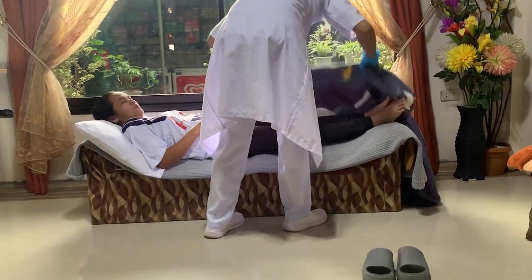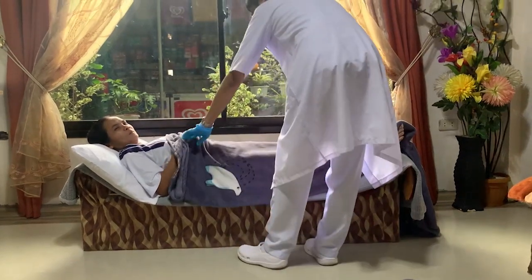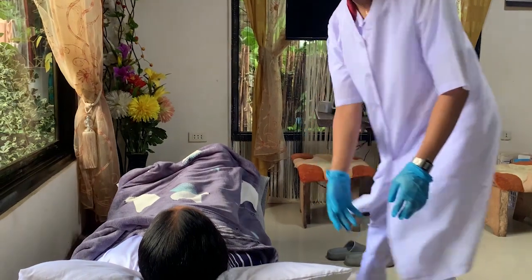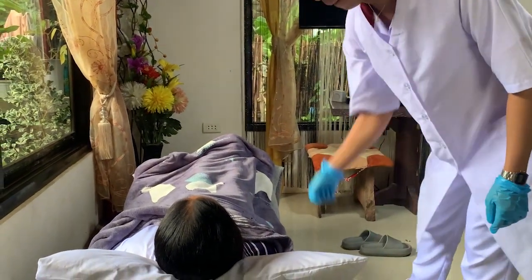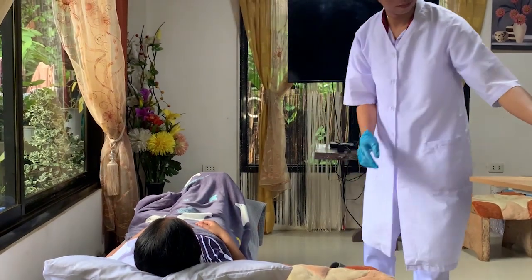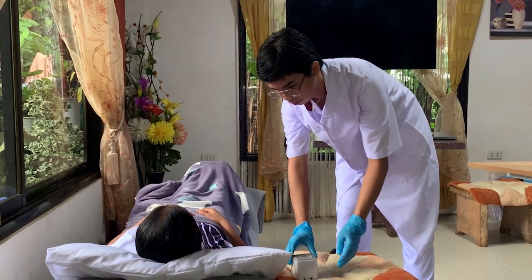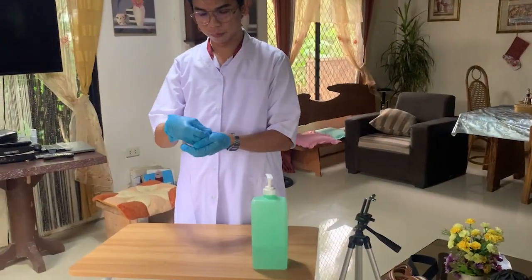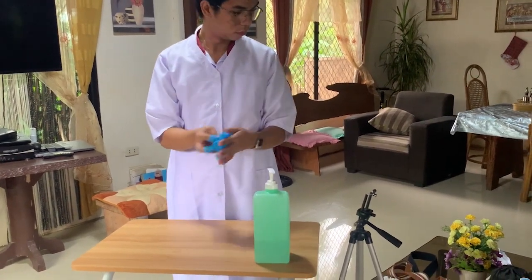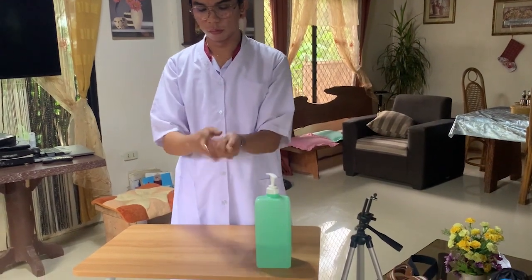Remove the gait belt and clean the transfer aid per facility policy if not indicated for single client's use. We're going to remove the gloves and other PPE if used. Perform hand hygiene. Proper cleaning of equipment between client use prevents the spread of any microorganisms.